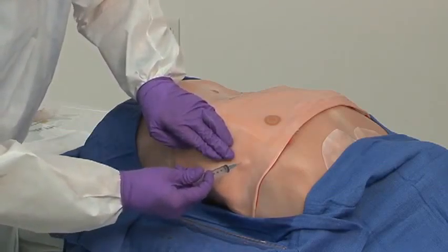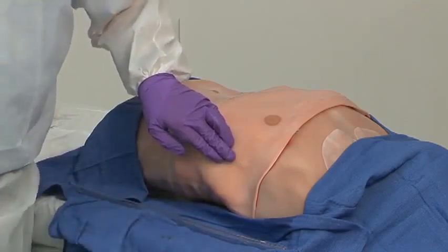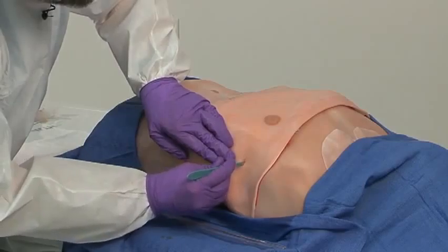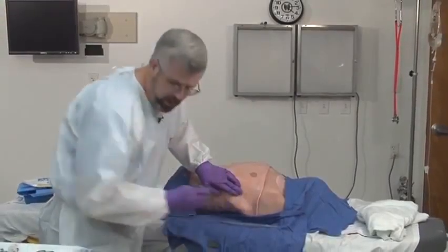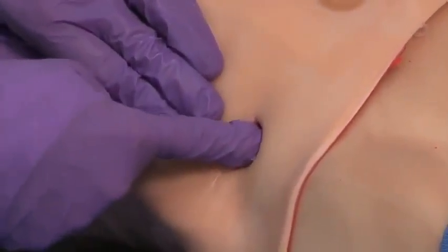I usually like to go down right on top of the rib that I'm going to be making my incision over. I'm then going to take a 10 blade and make an incision approximately 2 to 2.5 centimeters in length over the rib, right down onto that rib. Now, what I like to do is actually verify I'm on top of that rib. I can feel that rib underneath my finger here.